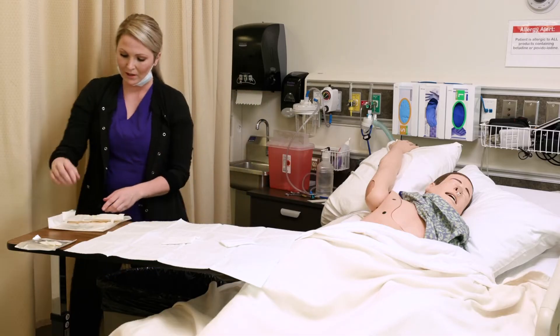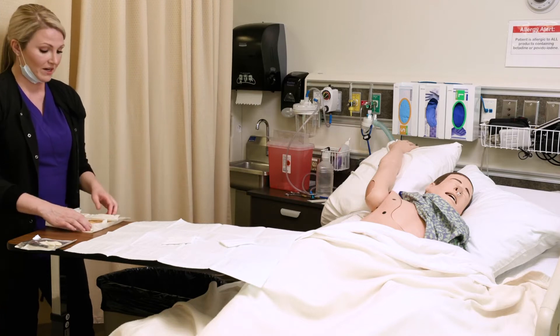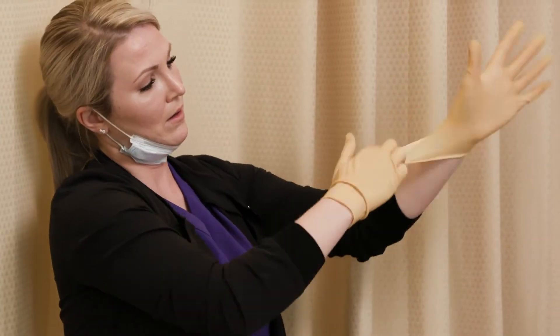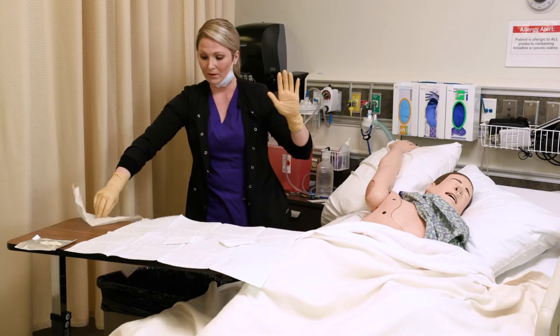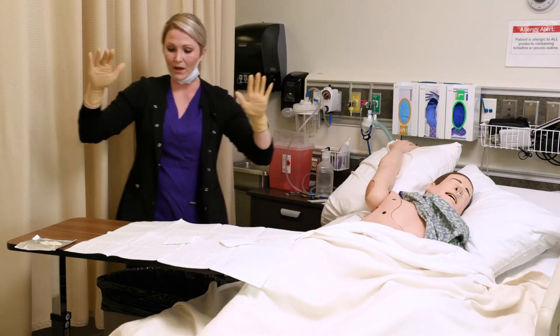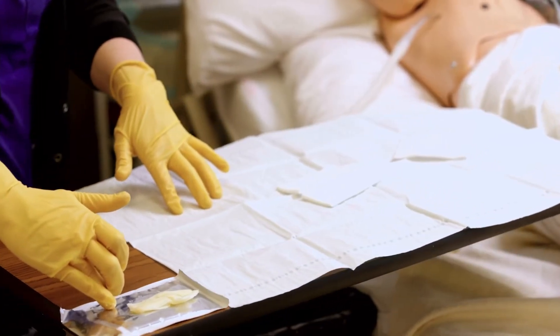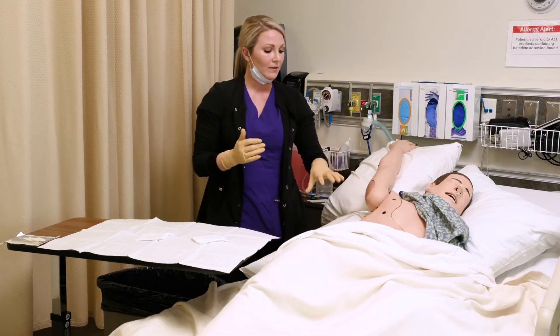Now that I've set up my sterile field, I'm going to go ahead and apply my sterile gloves. Make sure when you do this that you still have direct visualization of your chest tube insertion site and you're not contaminating your sterile field. Now I'm completely sterile. I'm going to discard and then sterile to sterile, pull my sterile supplies over. I've already cleansed the site, I've applied my sterile gloves, and the site has now dried.